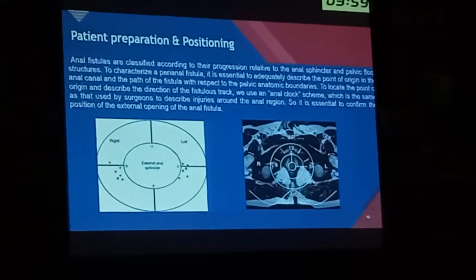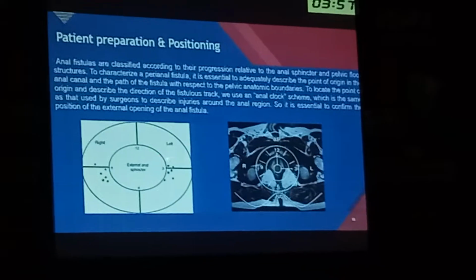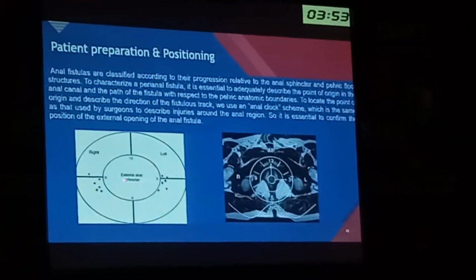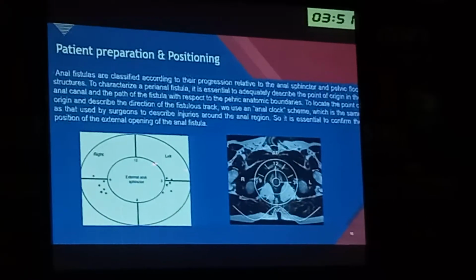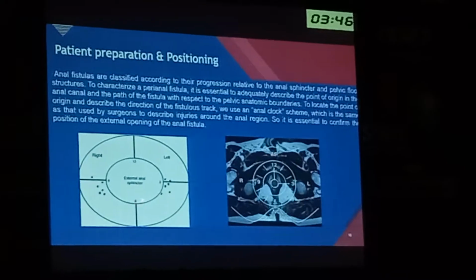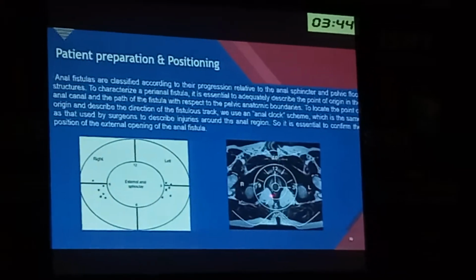That means in lithotomy position, if you find one external opening here, which clock is it? 2 o'clock. Here it is 3 o'clock. If it is here, it is 6 o'clock. That is also mentioned here.